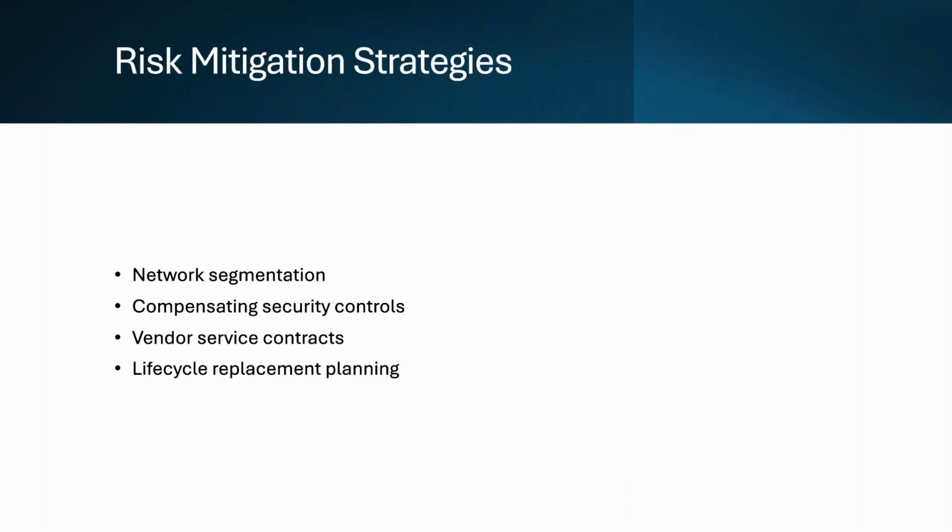Vendor service contracts ensure timely maintenance and access to patches or updates when available. Negotiate contracts that include cybersecurity support and clear response times for security incidents. These strategies allow us to manage risks without compromising patient care. Even if you can't immediately replace devices with an outdated operating system, you can implement layers of protection to reduce risk.